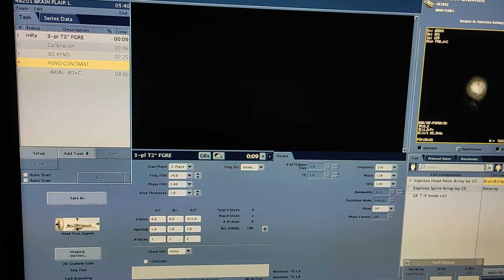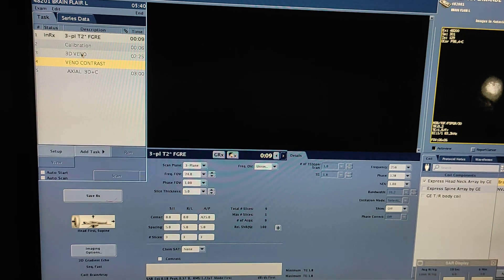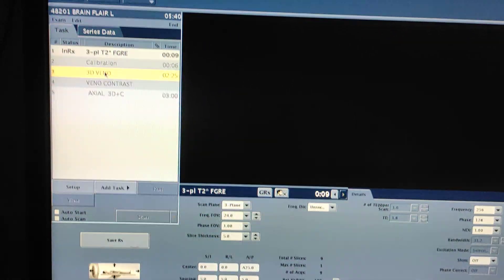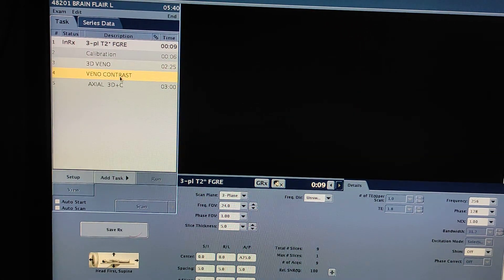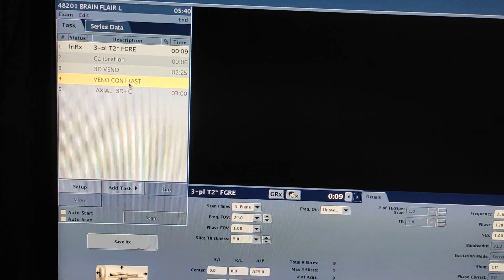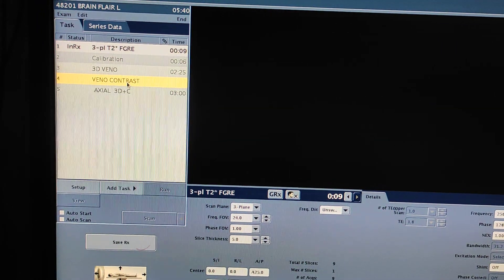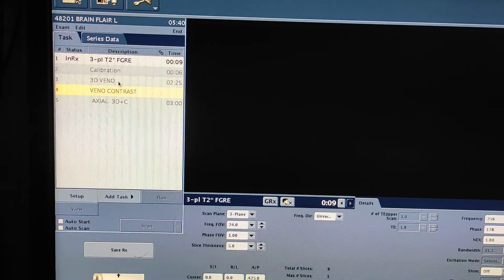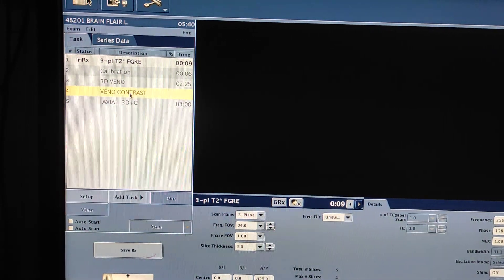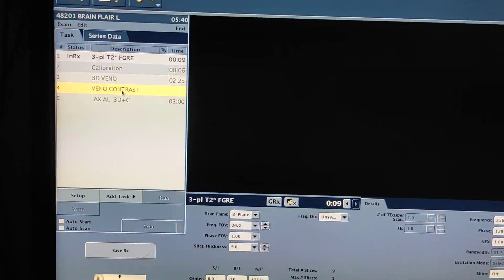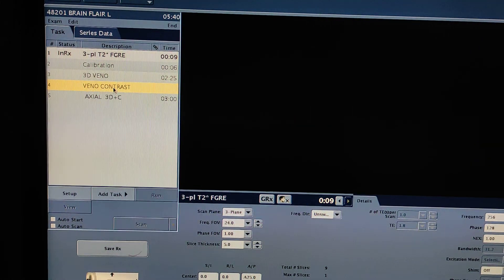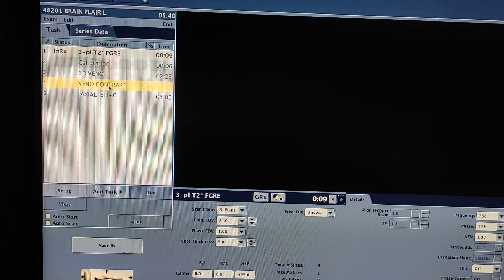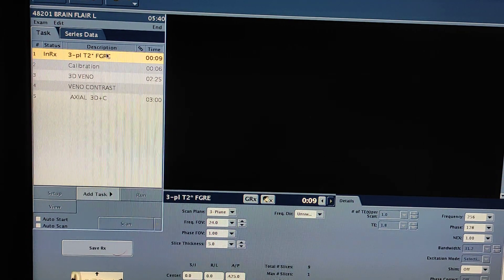First of all, you have to do a routine scan with a 3D sequence. After that, you have to do contrast. Always take a 3D sequence before contrast, because you have to compare it with a flow-related sequence versus the contrast-enhanced sequence. So here I am doing direct contrast.